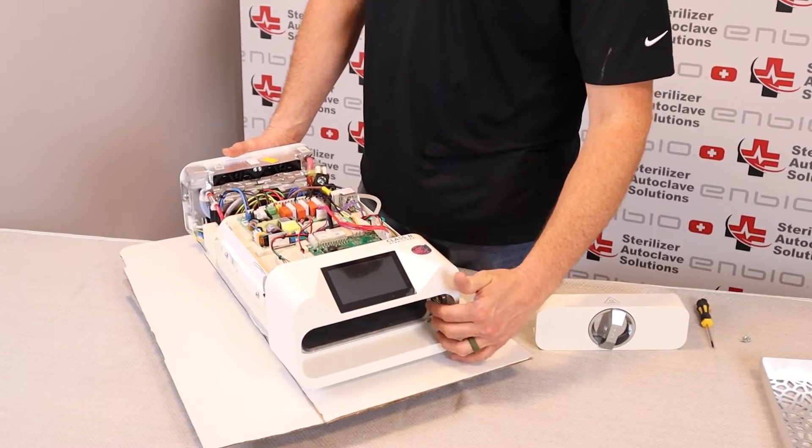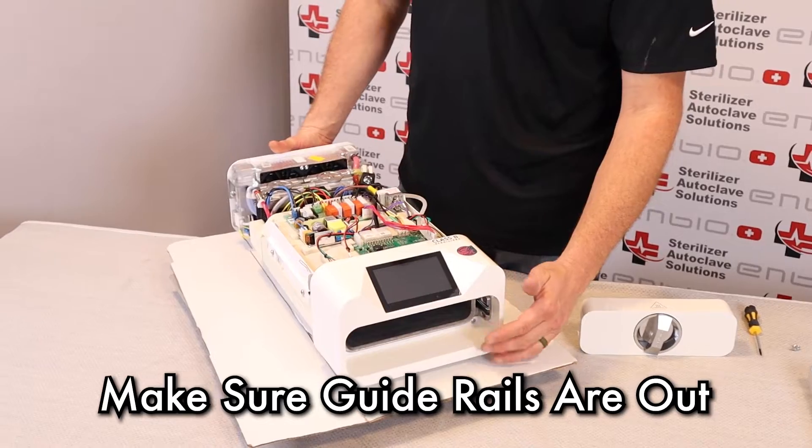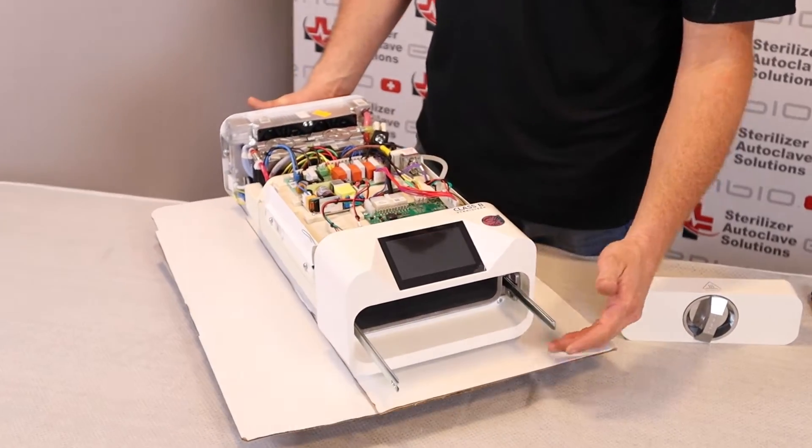You want to make sure that the guide rails are out. If they are tucked back in there, you can lift up on the back of the machine and it will roll out.